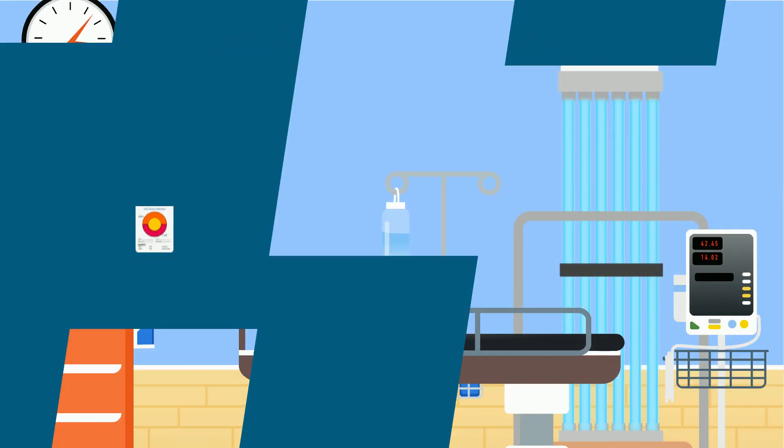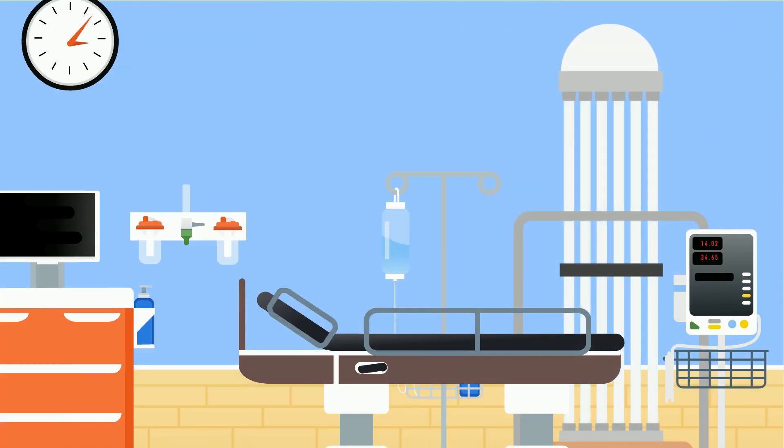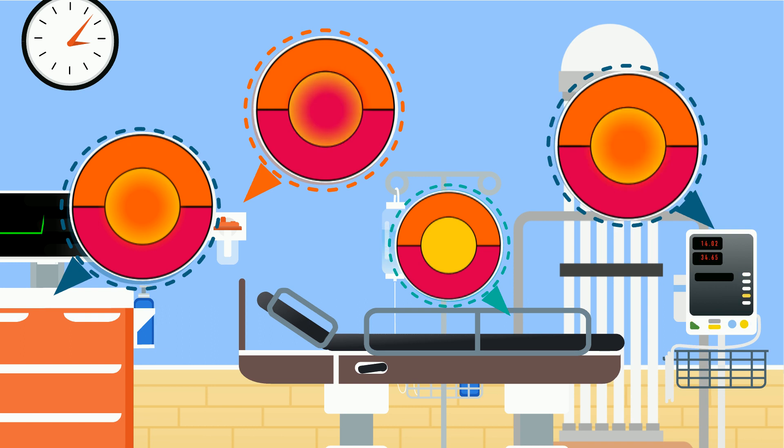After the disinfection cycle has been performed, it is easy to see how much UVC a surface has been exposed to by looking at the middle area of the card.